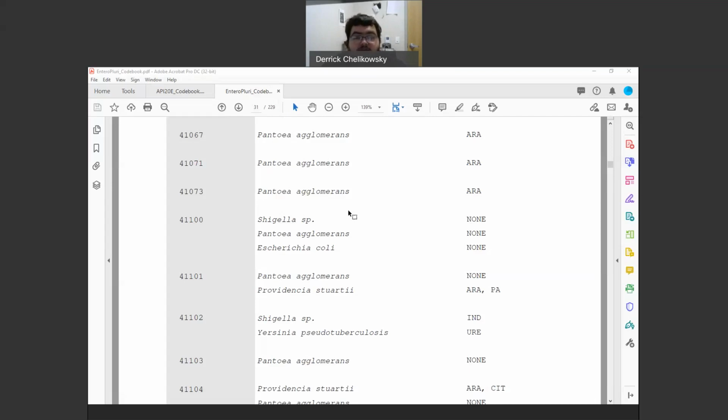In your case, if you get to an identification of something, and I haven't looked at this entire book, so I don't know exactly what we're going to get. Since Yersinia is here, let's go with an extreme example. Let's say you get the choice of either Shigella species, Yersinia pestis, and E. coli. For those of you that don't know, Yersinia pestis is the bubonic plague. We don't have that. We don't have Shigella, therefore it has to be E. coli. I don't know if that's actually somewhere in here.